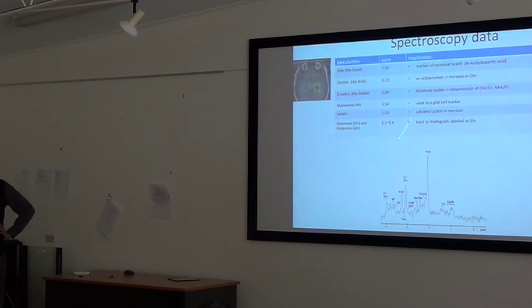I picked the seven major ones. There are four big brothers, which are NAA, choline, creatine, and MI, and then some little ones: lactate, and the twin brothers glutamate and glutamine. NAA is this resonance at 2.02 ppm, and it's usually the marker of neural health. The second is choline, which I call the bad one, because an increase of choline always indicates active tumor.